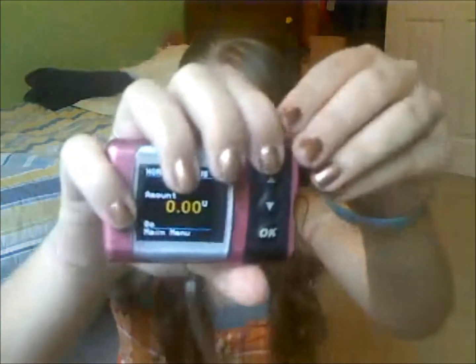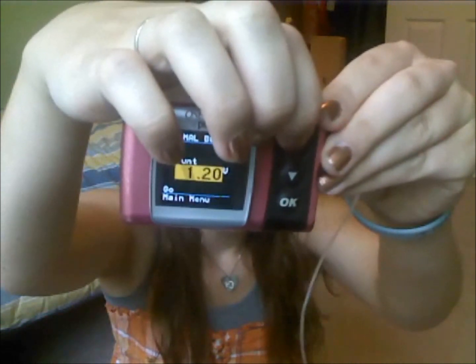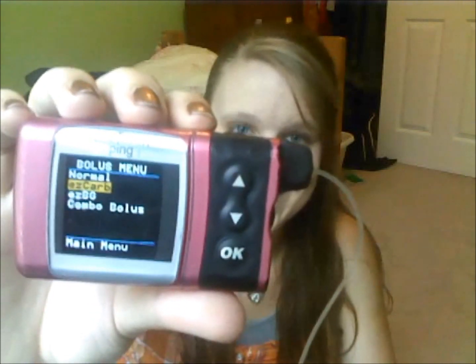And basically, a normal bolus would be if you had a great blood sugar and you knew your insulin to carb ratio, you could figure out in your head, and you would just go ahead and bolus based on how many units you know that you need. So let's say I need 2 units. My insulin to carb ratio is 1 to 10, and so if my blood sugar was good and I knew I was having 20 grams, I would just go ahead and put in 2 units and bolus for that.